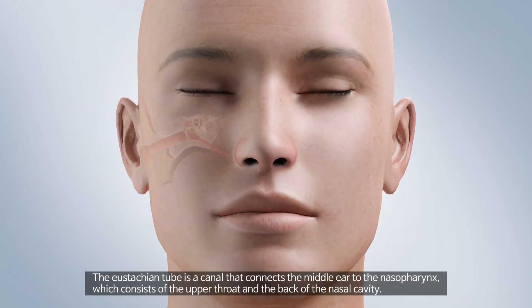The Eustachian tube is a canal that connects the middle ear to the nasopharynx, which consists of the upper throat and the back of the nasal cavity.